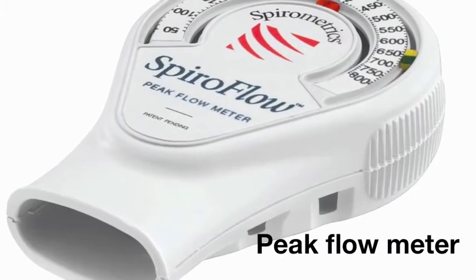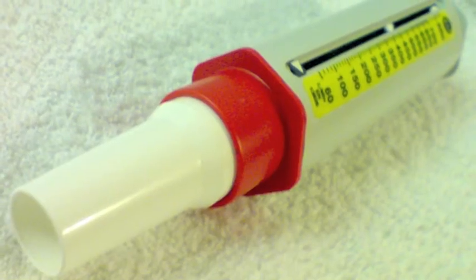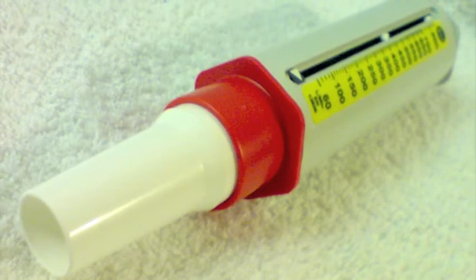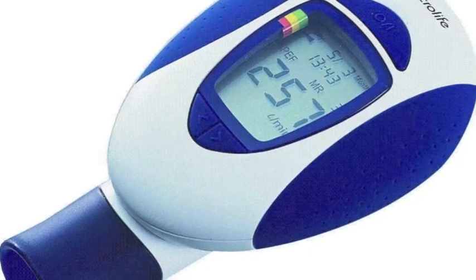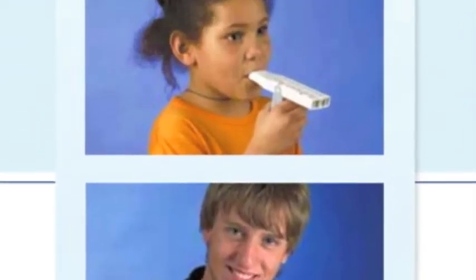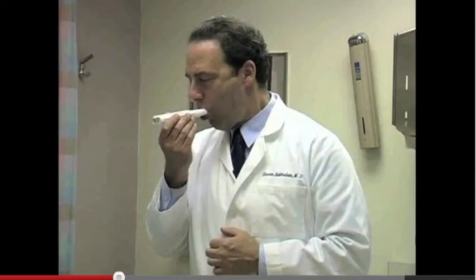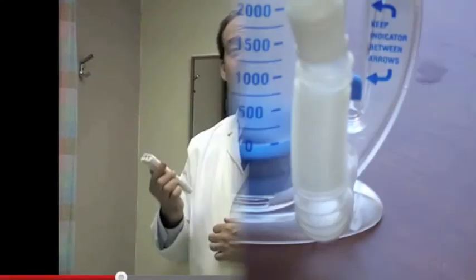A type of spirometer used clinically to measure the flow of air is a peak flow meter. It's a device used to measure a person's maximum speed of expiration. Overall, peak flow readings are higher in healthy people and lower when airway resistance is present. Peak flow meters can be used to indicate the onset of a respiratory problem or to monitor a treatment.